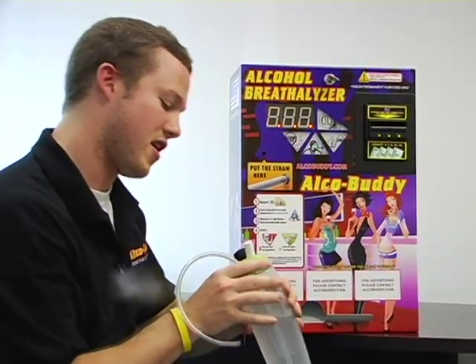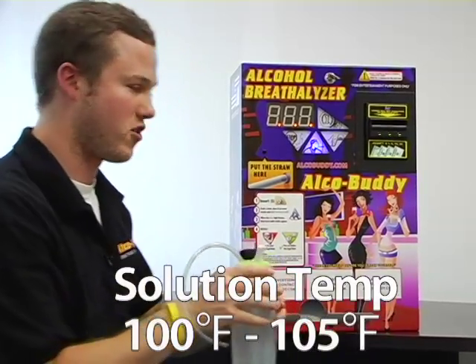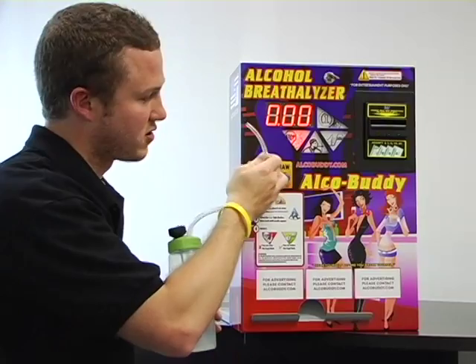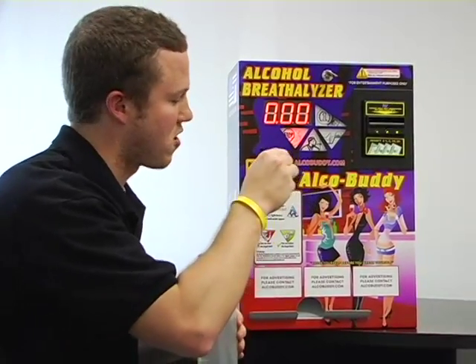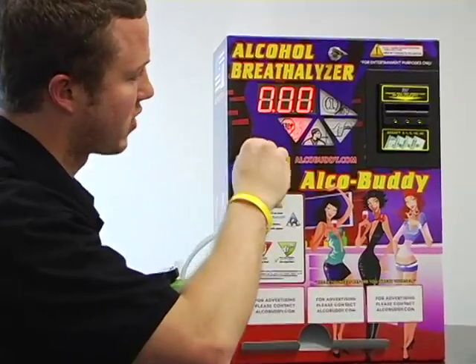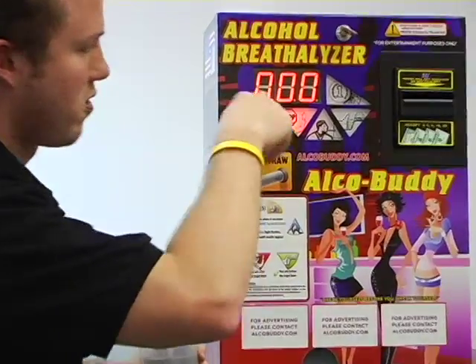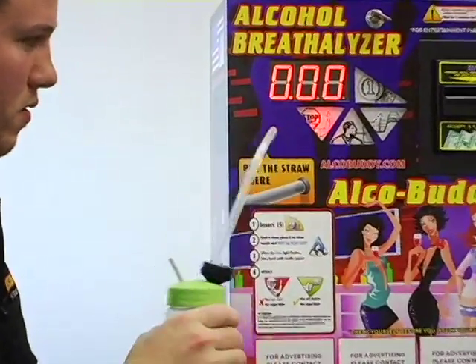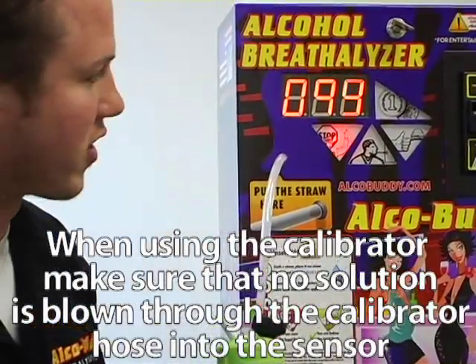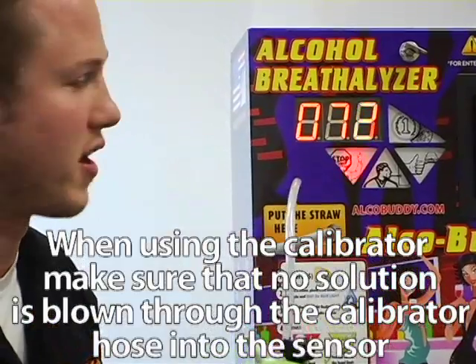Our solution here is at 99 degrees Fahrenheit, so that is perfect. What we are going to do is hook the tube up to the nozzle on the front where you normally place the straw. No one blew in there yet, so it came up 0. We will wait for the next countdown and then give a nice thorough blow for a few seconds.